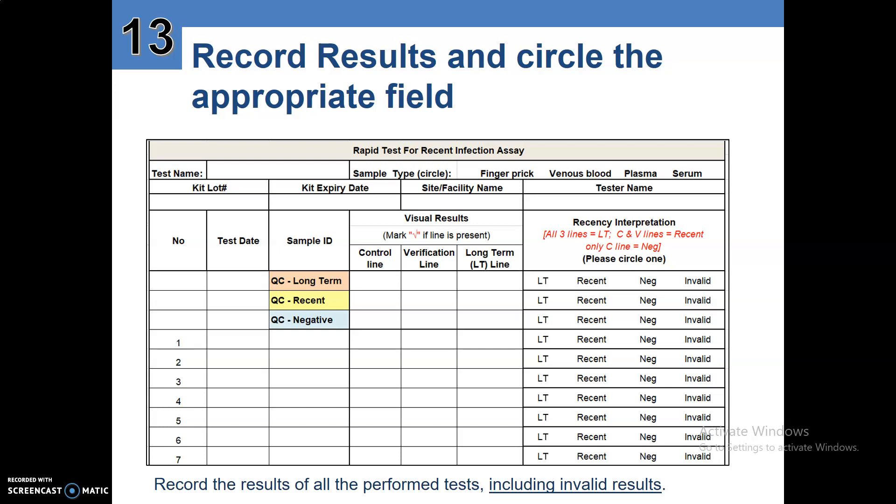Tick if the line is present for the visual results. For the control line, if it's present, tick. If the verification line is present, tick. If the long-term line is present, tick. These are the results interpretation: all three lines is long-term; control line plus verification line is recent; and if there is only the control line, that is negative. Circle the appropriate result.